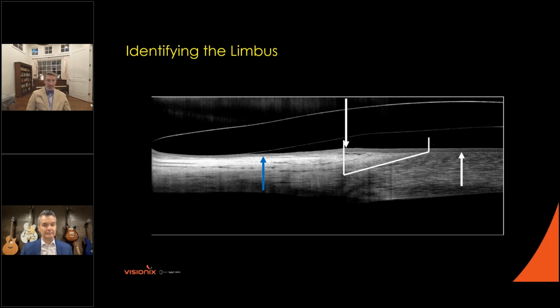This is one of those amorphous questions, which there's no great answer to. The way I describe this to students and to my associates is that you just have to extrapolate in your mind: this lens that you put on and image when you insert it, is it by the end of the day going to touch the limbus? And if you feel like as that lens settles, it's going to hit the limbus, you have to make changes.